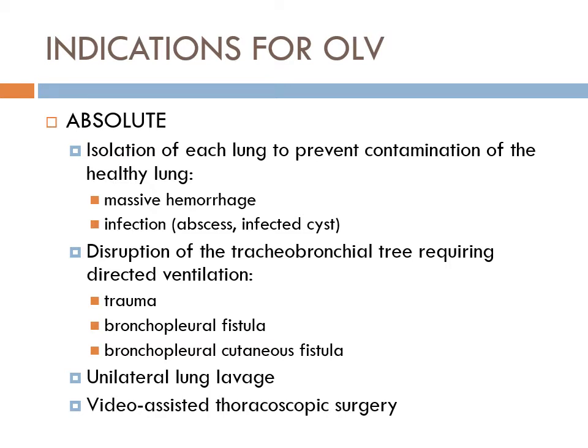You're also feeling that the bag has no compliance. But say you're in the lungs. So now you can kind of rest easy, right? You got the tube in the right spot and you're able to ventilate them. You put on a little bit of gas, you throw them over on the circuit, and now you can get ready to tape your tube, right? If you're happy.